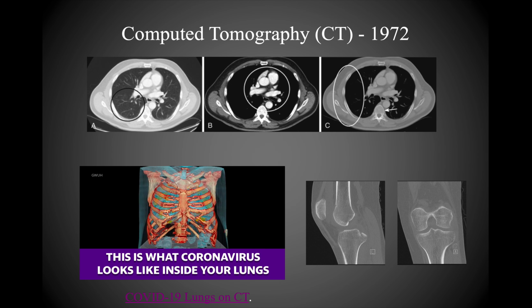We also have significantly enhanced data manipulation capabilities, which includes windowing as well as 3D rendering. You can see down here a 3D rendering of a CT scan of a patient that has COVID-19. If you want, you can watch this video that I put a link to on the slide, which walks you around this CT scan. You can see how some coloration has been added, so you can appreciate where the COVID-19 pathology can be seen within the lung tissue itself.